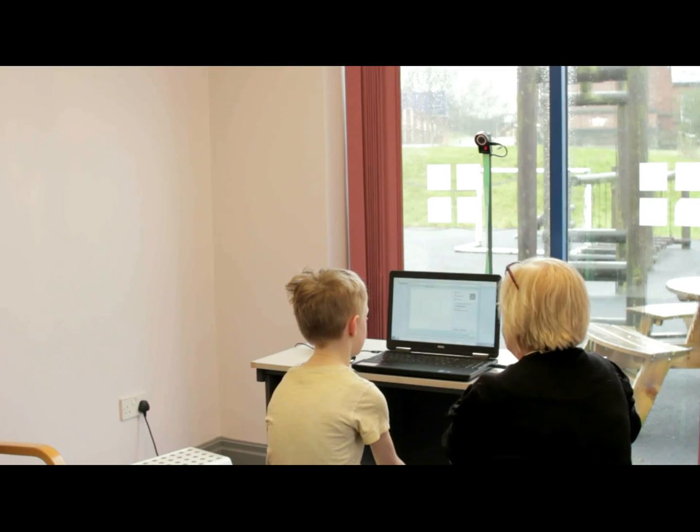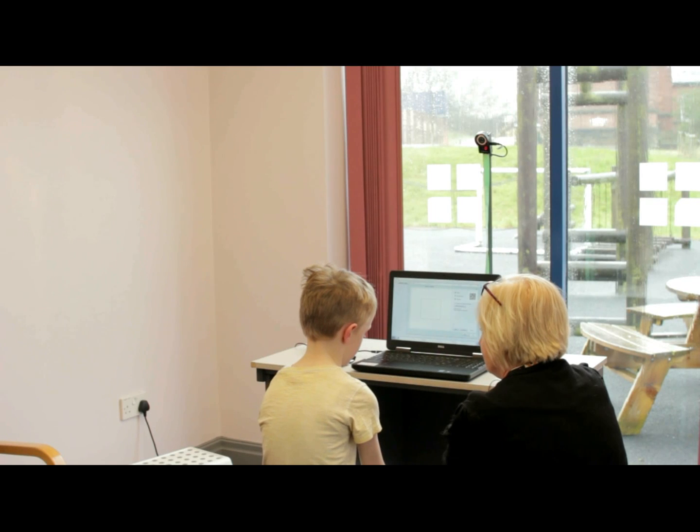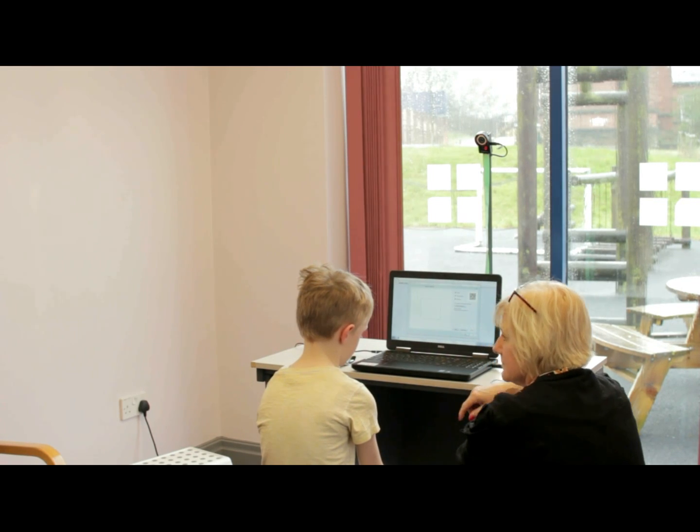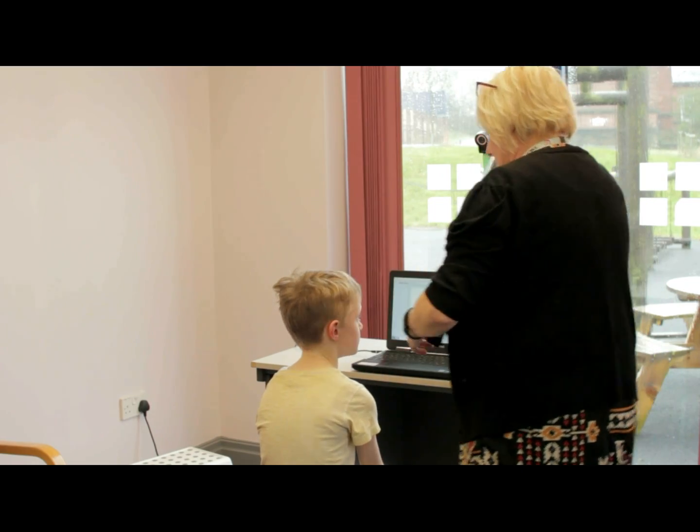Will it go into my brain? No, you're just going to wear a headband. Will it make me bleed? No, it won't make you bleed. So we'll put the headband on and then you can have a practice test.